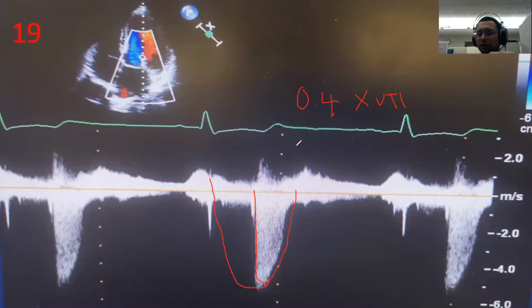So whenever you see mitral valve prolapse with a late systolic murmur, always beware. Don't just look at the size of regurgitation. Also look at the length, or the time it takes for the regurgitation to happen. Is it okay, Saravanan? So will this be severe? Nope. Usually late systolic MR is almost never severe.